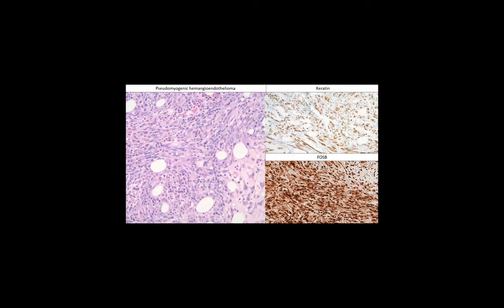These typically also have a lot of eosinophils, so that can be a clue that you're dealing with a vascular neoplasm. Again, giant cells in the background, we have these plump spindled cells that almost look sort of rhabdoid. That's how this tumor got its name of pseudomyogenic. These tumors are keratin positive, and they stain for the FOSB marker. These can be tricky because patients can present with multiple bone lesions and they're keratin positive, so it might lead you to think about metastatic disease. But again, these patients are often young. So if you have a keratin positive tumor that's multifocal in a young patient, think about pseudomyogenic rather than a metastatic process.